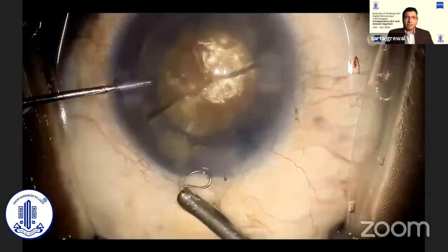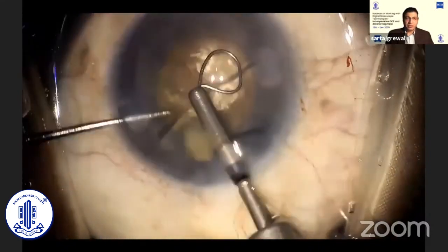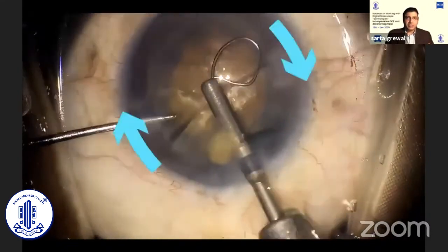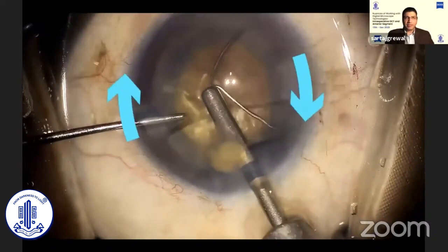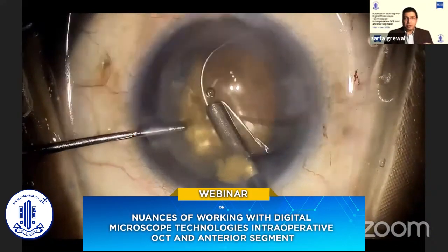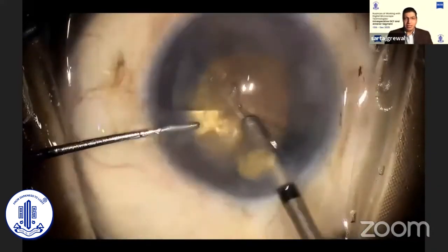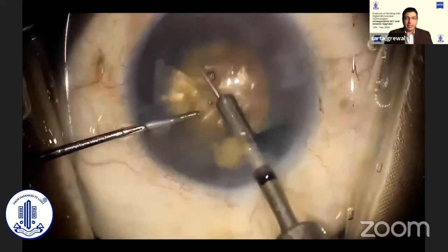After the nucleus is divided once, if you wish to further divide the nucleus into quadrants, the nucleus tends to rotate along with the loop as it expands around the nucleus. So it is helpful to compensate for this by first under-rotating the nucleus before the second division. You can also use the second instrument again to keep the nucleus stable at this point.